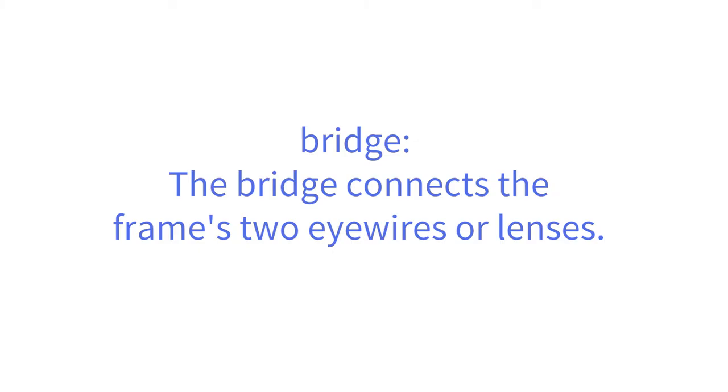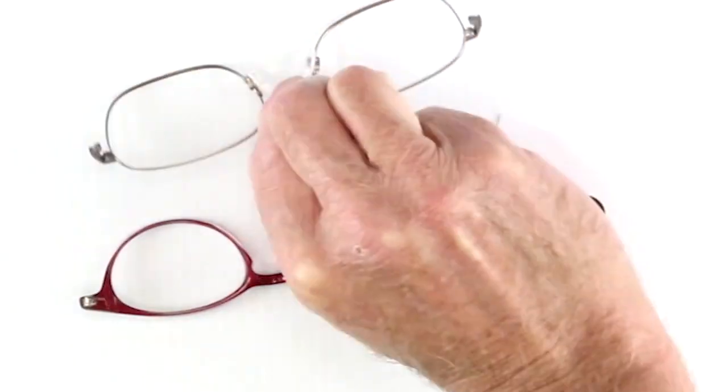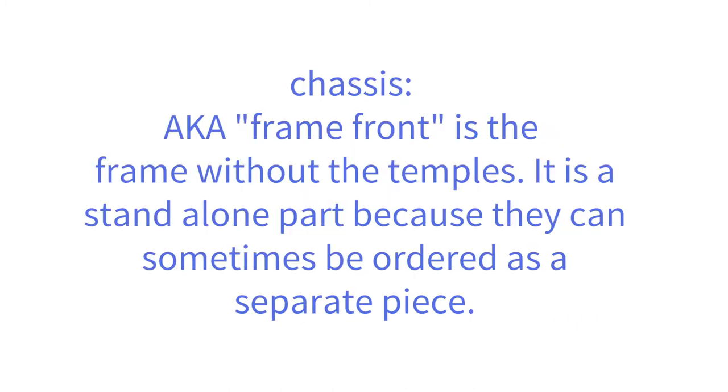The bridge connects the frames to eye wires or lenses. The chassis, or frame front, is the frame without temples. It is a standalone part because it can sometimes be ordered as a separate piece.